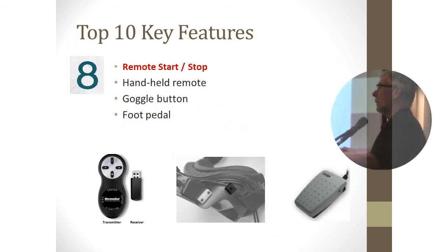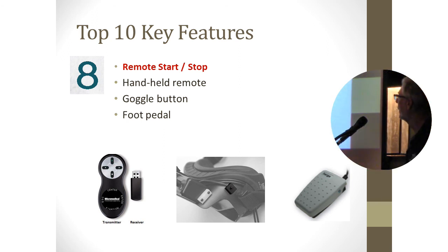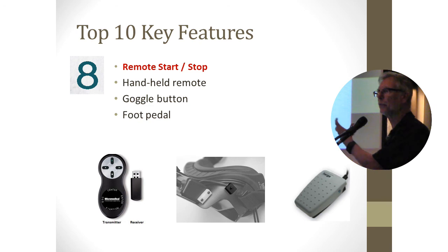We thought about how you start the system when you're doing a Hallpike, for example. Both of your hands are on the patient. And okay, now turn your head all the way to the right. I'm going to take you down. Don't worry. Here we go. You ready? 1, 2, 3. Down we go. Right? So how do you start the recording?